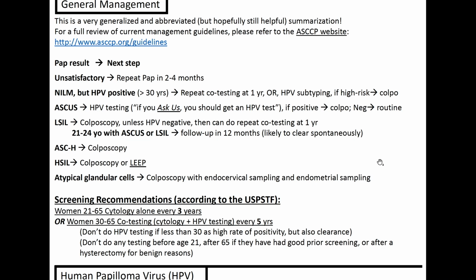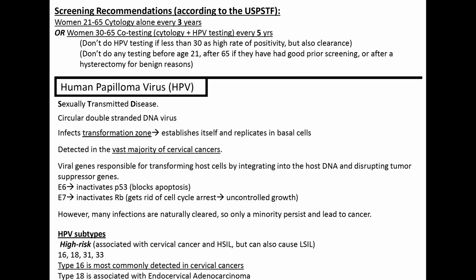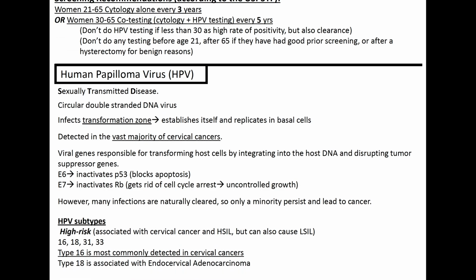So again, just be familiar with these treatment algorithms. I'm not going to go through all of them, but just refresh on those for your own education or for testing purposes, and just remember that what you're seeing under the scope and what you report does make a difference in the management of those patients.